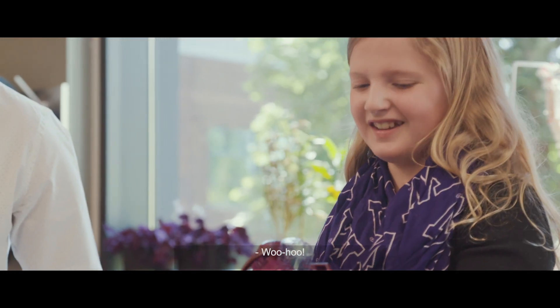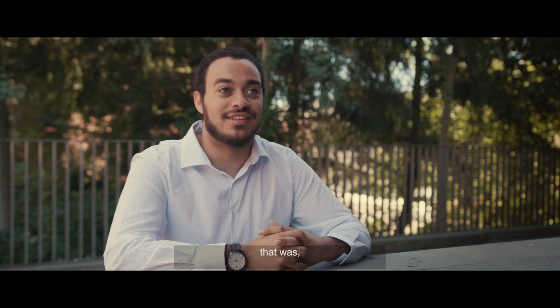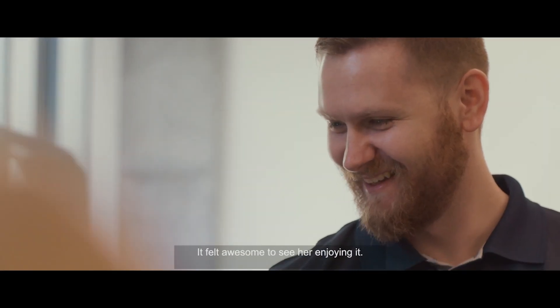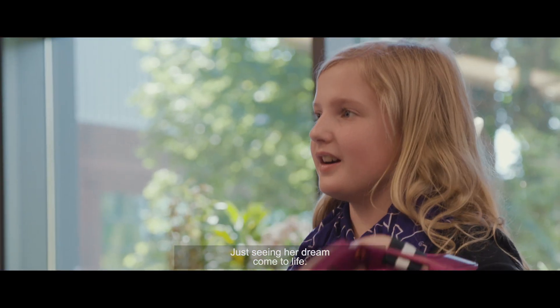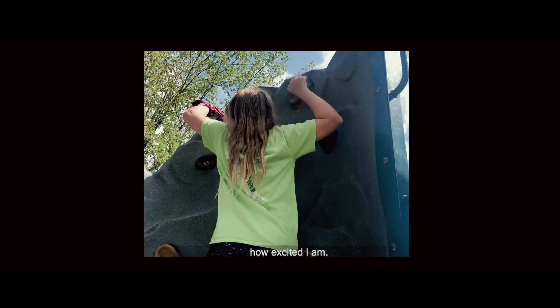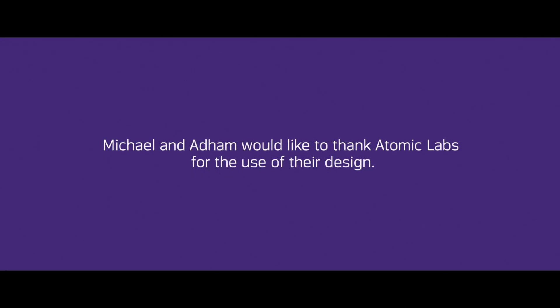Oh wow. Here goes. There we go. I worked so hard for this, and the first time she saw the device and seeing that smile on her face — that was one of the best moments I can say in my life right now. To see it in action was pretty magical. It felt awesome to see her enjoying it. It was a pretty emotional moment watching her do this thing we've been working towards for so long. Just seeing her dream come to life. It's hard to describe how excited I am. It's just amazing. It's amazing. Thank you.